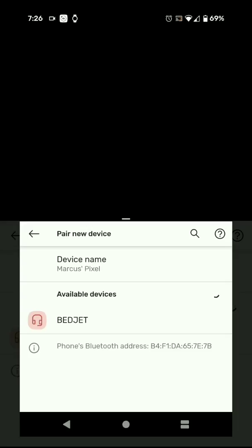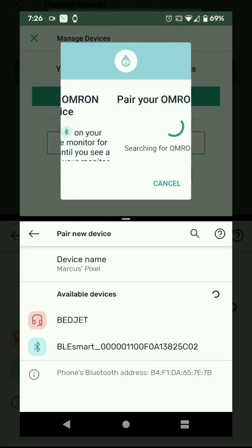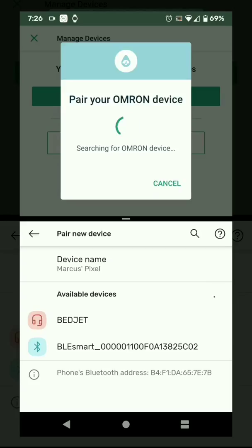Off screen, I am putting the device into pairing mode, which is going to make it show up as BLE Smart. At this point, if I go into pairing, the app is going to find the monitor, but it will not be able to connect to it.